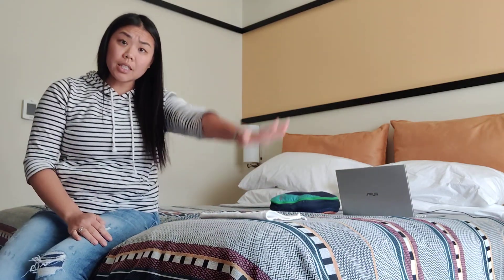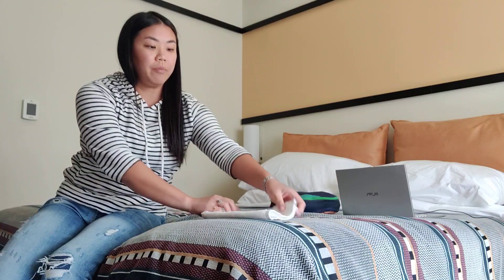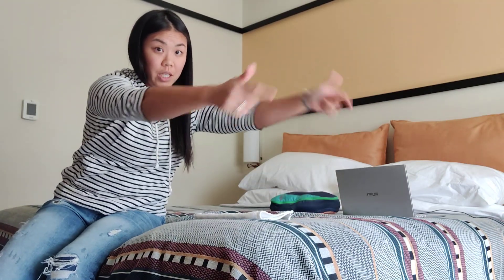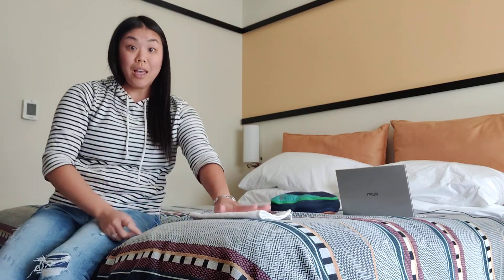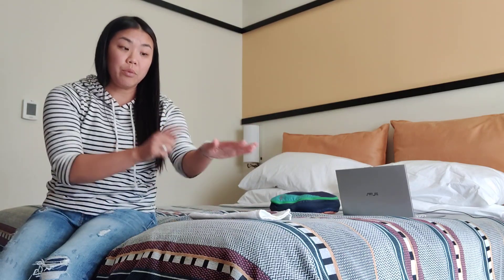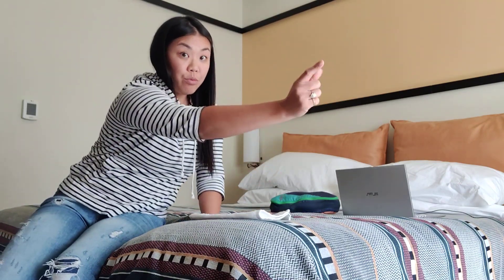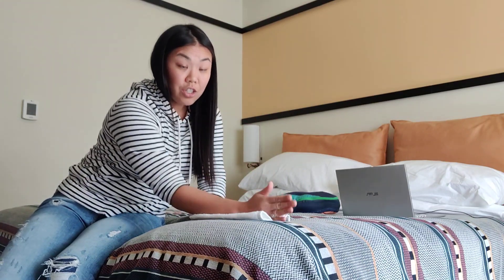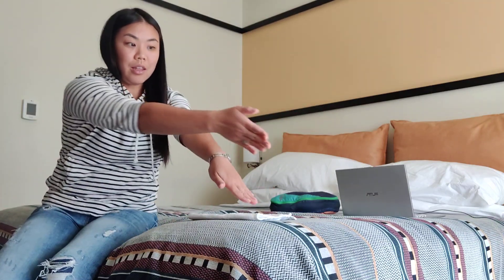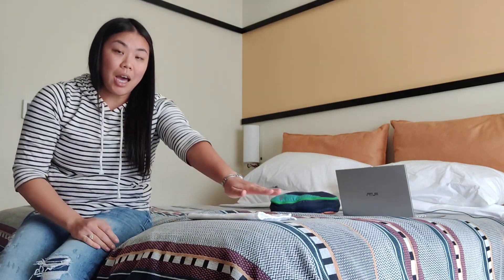Let's say it's their left wrist that's in pain. I put it toward the gantry — the gantry is right here and this is the table. I tell them: your wrist or hand is going to go on top of this towel, and that towel should be centered on the red laser line that comes to the gantry — not to the side, but centered. That red line continues on to your anatomy.